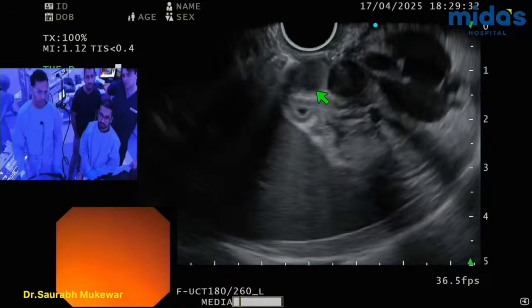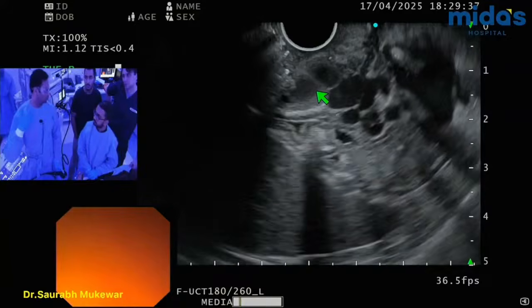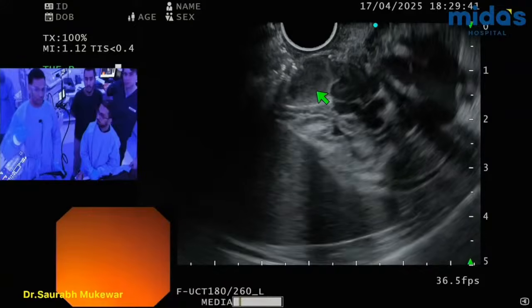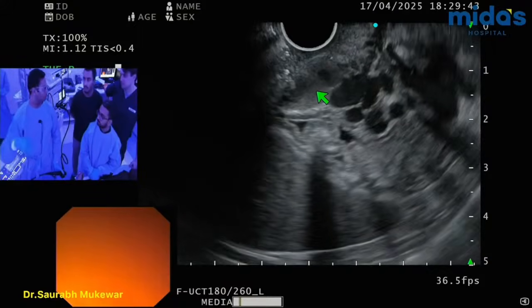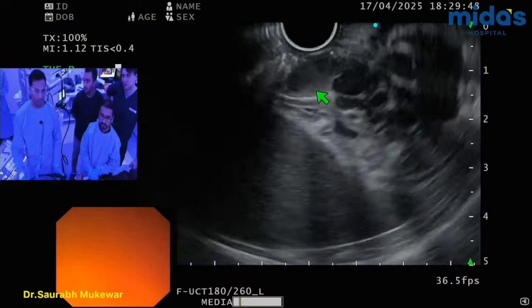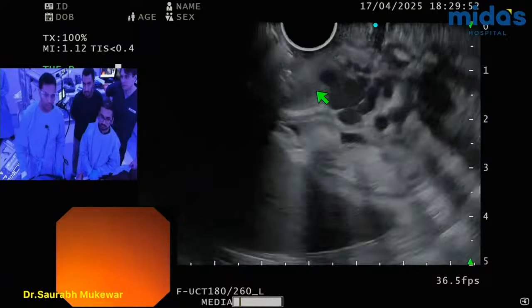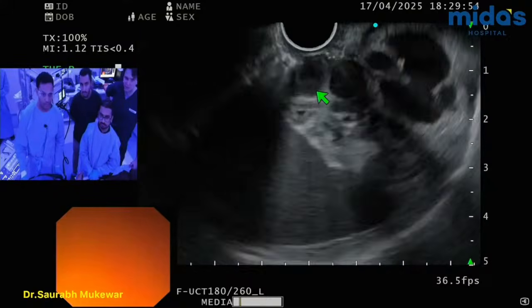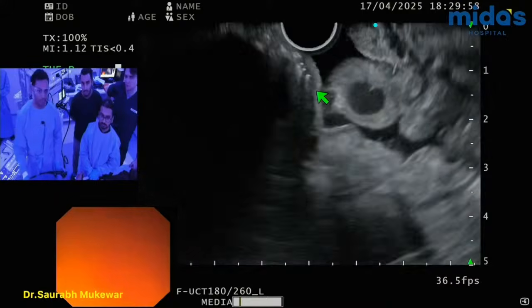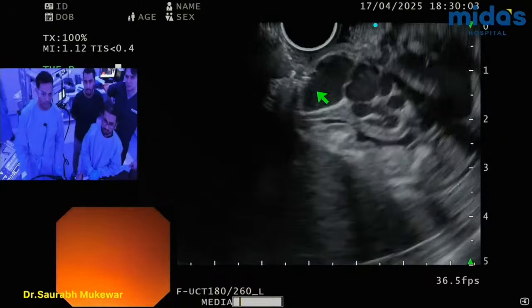People would say, based on prior evidence, that you can leave it alone, just because you stop the flow of blood coming into it, and it's really gone down. So this will die. If we need to do it, it's so small, I'm just going to leave it alone, I think. And this is the outflow coming from there, right? So I'm going to see what happens to him. I'll call him back in a month and see. I think he should not have any more bleeding with such a slow flow right now.